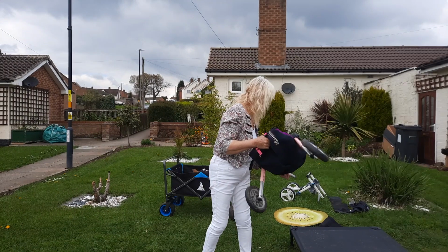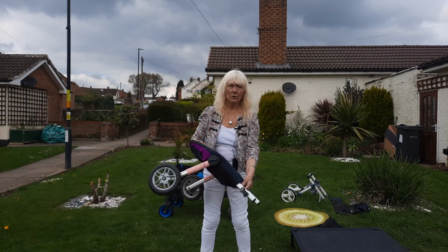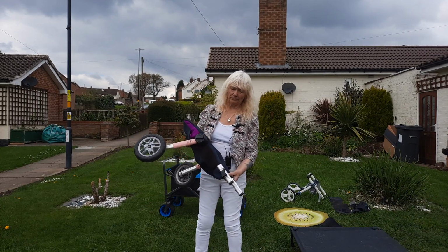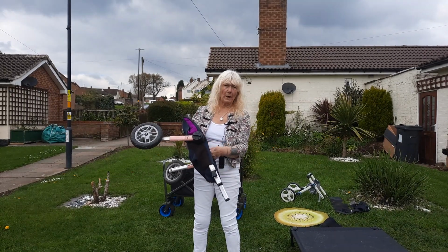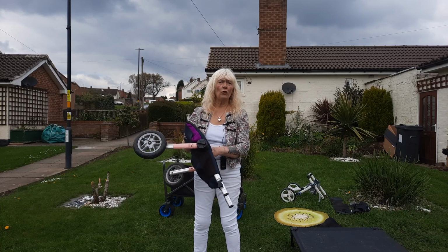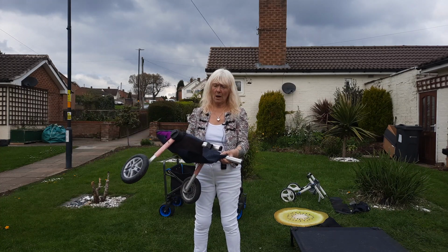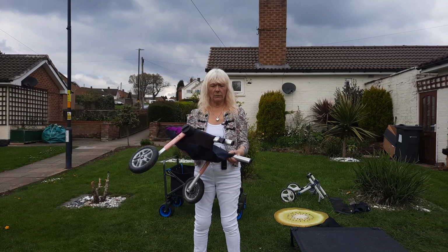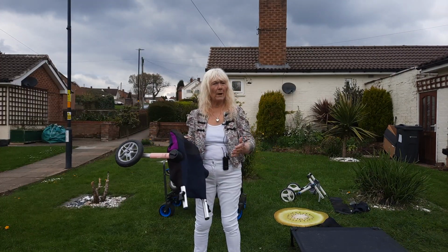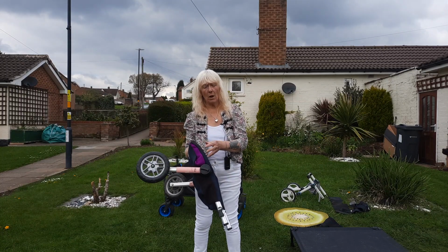While I've got it in my hand, I think, as I say, if you tuned in before, you'll know about this. This contraption that's sitting on it, obviously it's covered in Skylar's hair, because they molt, don't they, this time of year. When she came to us, there was just 2 rings for a dog's legs, obviously. Well, she's a double amputee, so she was just sitting on the rings. We put like a blanket on it, you know, to make it a bit more comfortable, but it wasn't really suitable. So one night, I had a light bulb moment, and I thought, hang on, why on earth doesn't she have something a lot longer? So out of the cupboard came an old wetsuit. I chopped the arms off, chopped the legs off, and then I slid it over this.